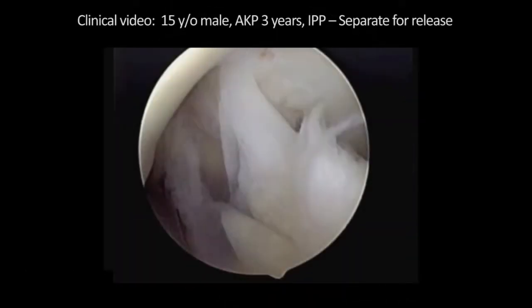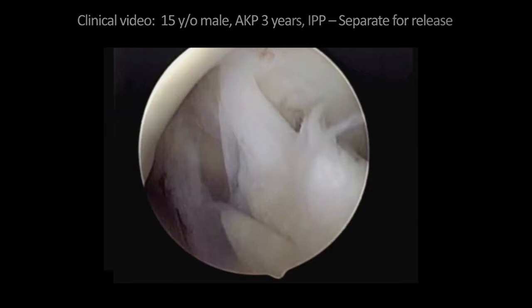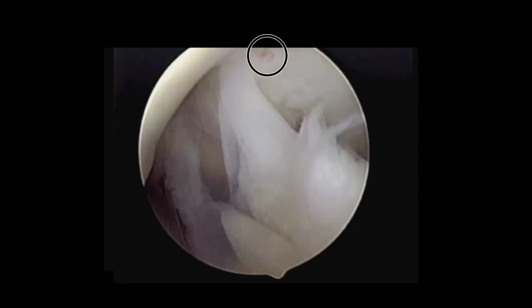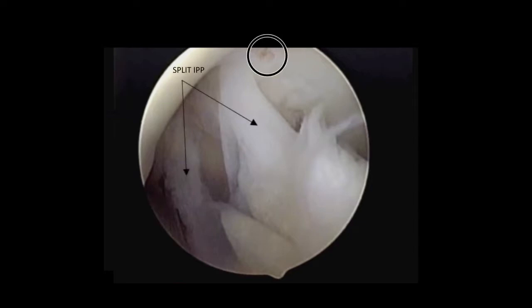In the first clinical case, before IPP release, the diagnostic arthroscopy was pristine. Viewing from the anterolateral portal, one sees a dollop of inflammation adjacent to a split IPP appearing normal.